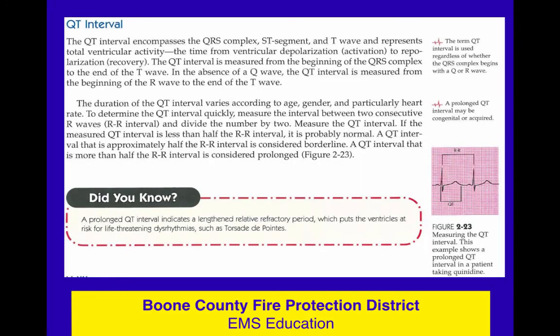Now here's a good slide that you can read more carefully, and as you know, the PDF printout, more or less, of these slides is included with your Moodle lesson, and so you may want to read and review these things, maybe print them out, whatever you want to do. Maybe you want to watch this video screencast again. Really good information here about the QT interval. It's the lengthened time for the patient's ventricles to depolarize and then reset.